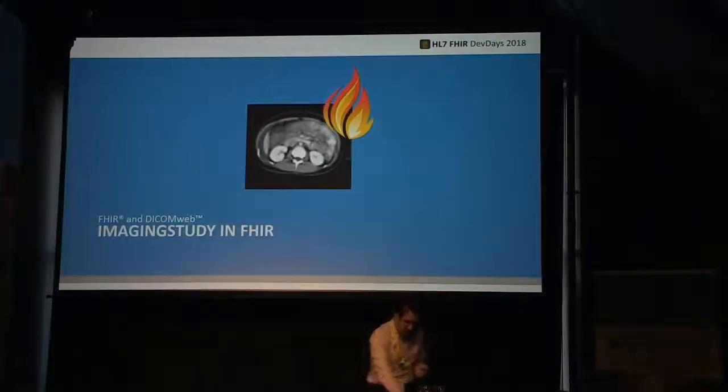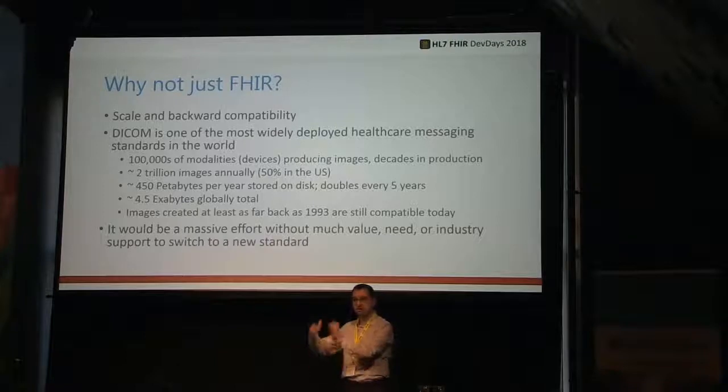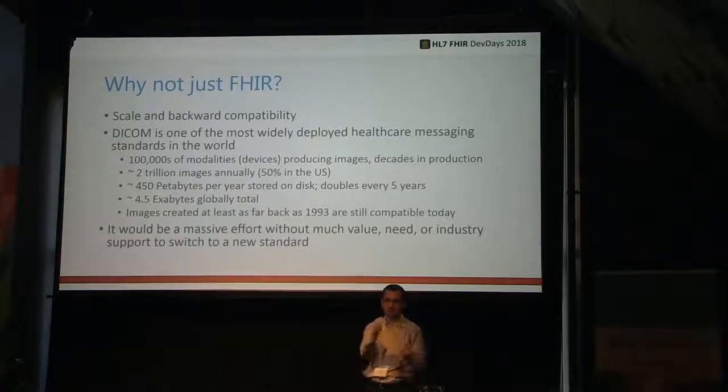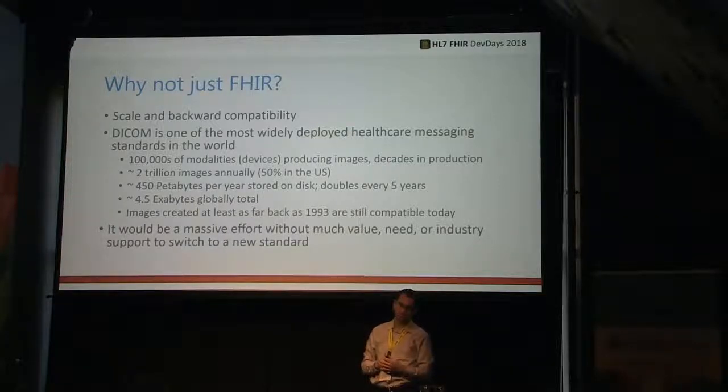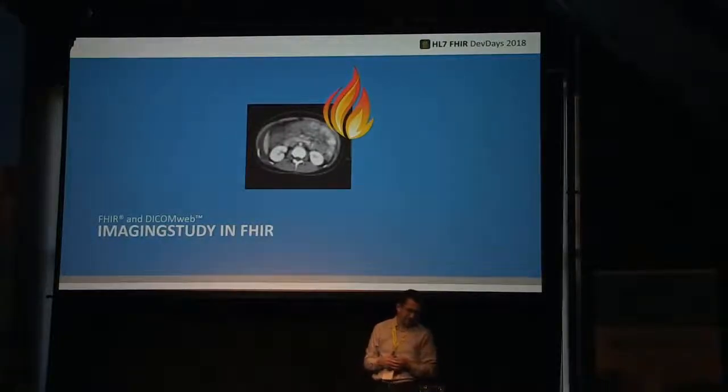The other thing is DICOM, of course, also defines much more than just how you store images. It's a standard for storing, transmitting, displaying, even printing images. It's very wholesome in that regard. And again, it's not just a JPEG file with a bunch of tags. There's a lot more to it. All right, is that clear so far? So I'm sorry, DICOM's not going anywhere, unfortunately. All right, within FHIR, usually your gateway to DICOM is the imaging study resource.